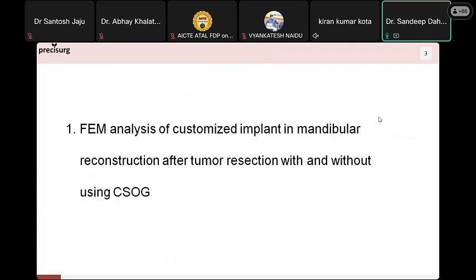Also, it is a universal implant and can be useful for any patient, but related to that particular dimension. If the patient's bone dimensions are related to this patient, then this implant can directly be used. Otherwise, we can change this particular dimension. Also, because of the customization of the implant, the surgical time can be reduced and it is easily inserted into the patient's body. In the follow-up result, slight deviation of the implant from its original position indicates changes in stress and stretch pattern during the locomotion of the metatarsophalangeal joint implant.